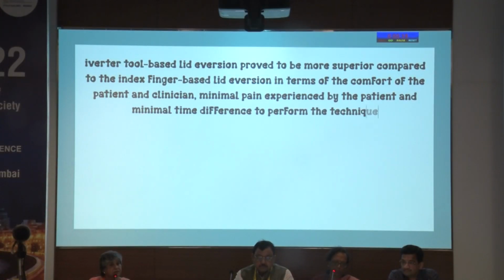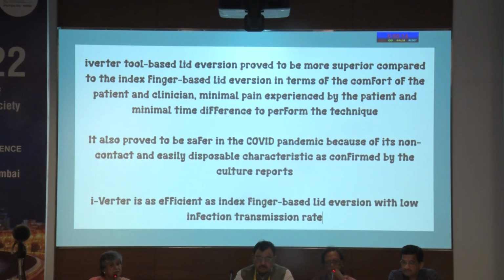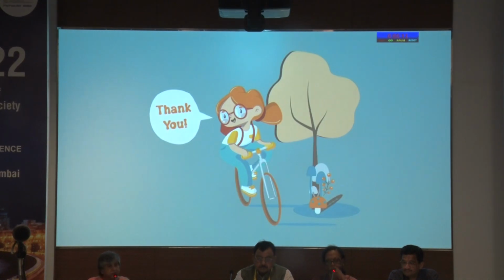The conclusion was that iVerter was equally efficient as lid eversion by fingers, but also safer during the COVID pandemic, wherein there's a risk of transmission of infection, and also the patient experienced minimal pain.